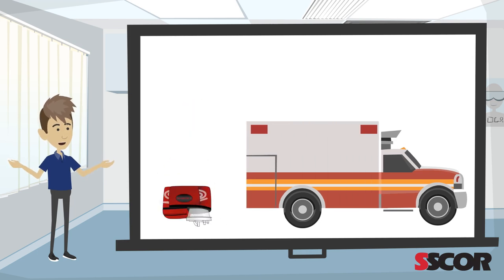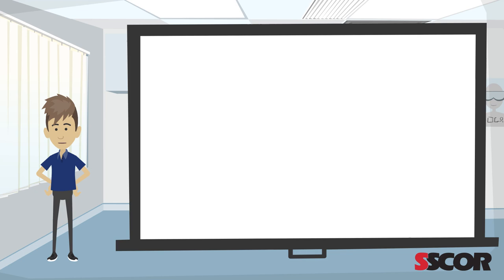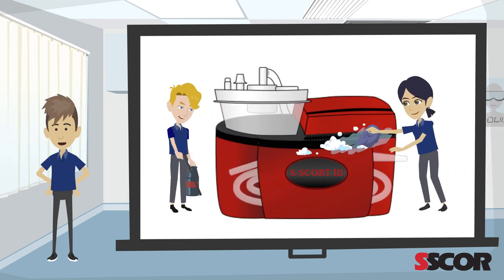During an emergency, equipment can take a hit. The Escort 3 has an internal foam core that securely protects internal components from drops, falls, or rough handling. The red vinyl coated nylon case is very durable and easy to wipe down.